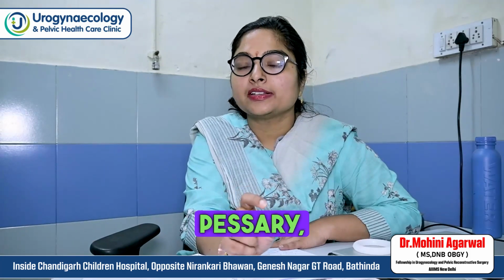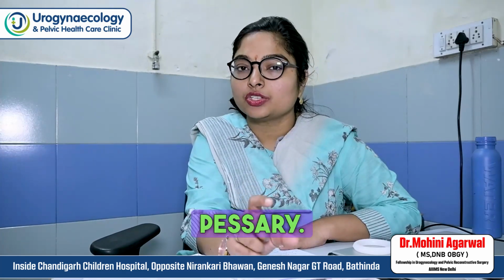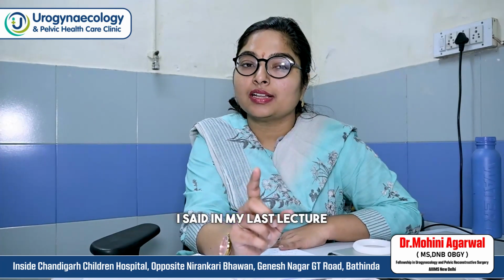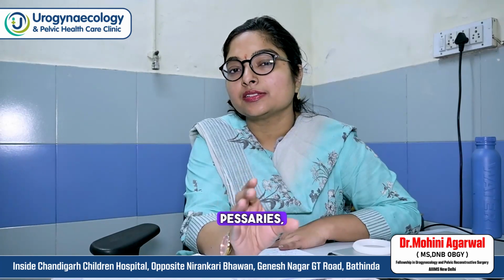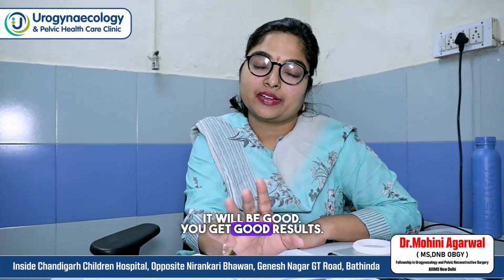Specifically for the Hodge pessary, when there is a case of narrow vagina or short vagina, you can try the Hodge pessary. I said in my last lecture, in the contraindications of pessaries, that with a narrow vagina you usually don't insert a pessary because it is very painful. So here you can try a Hodge pessary, and you get good results.